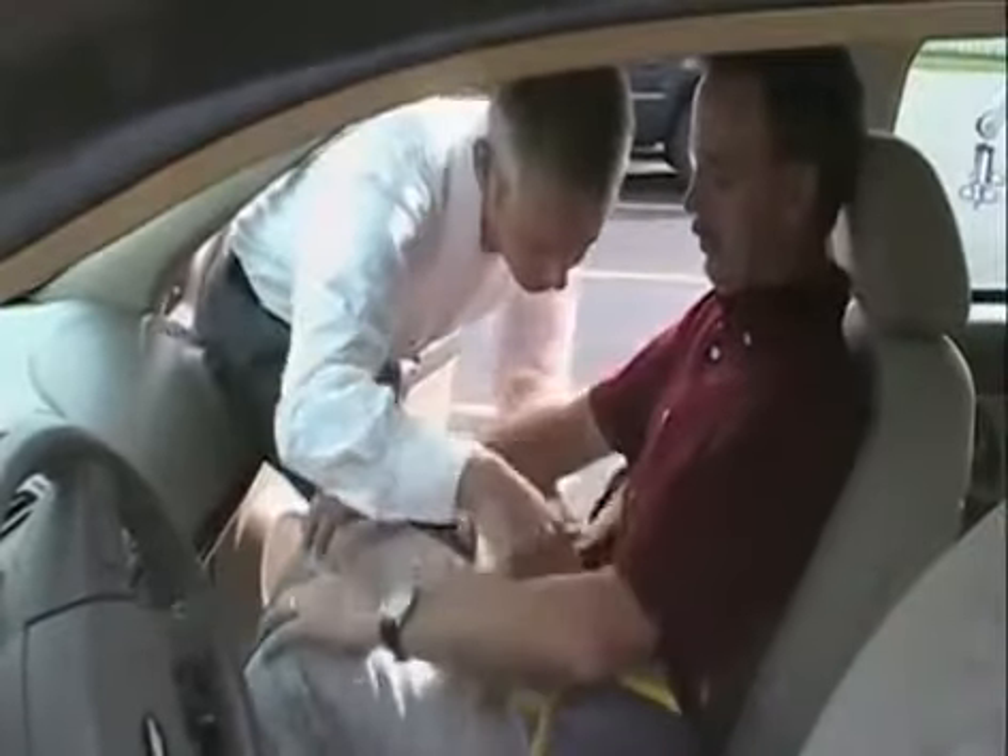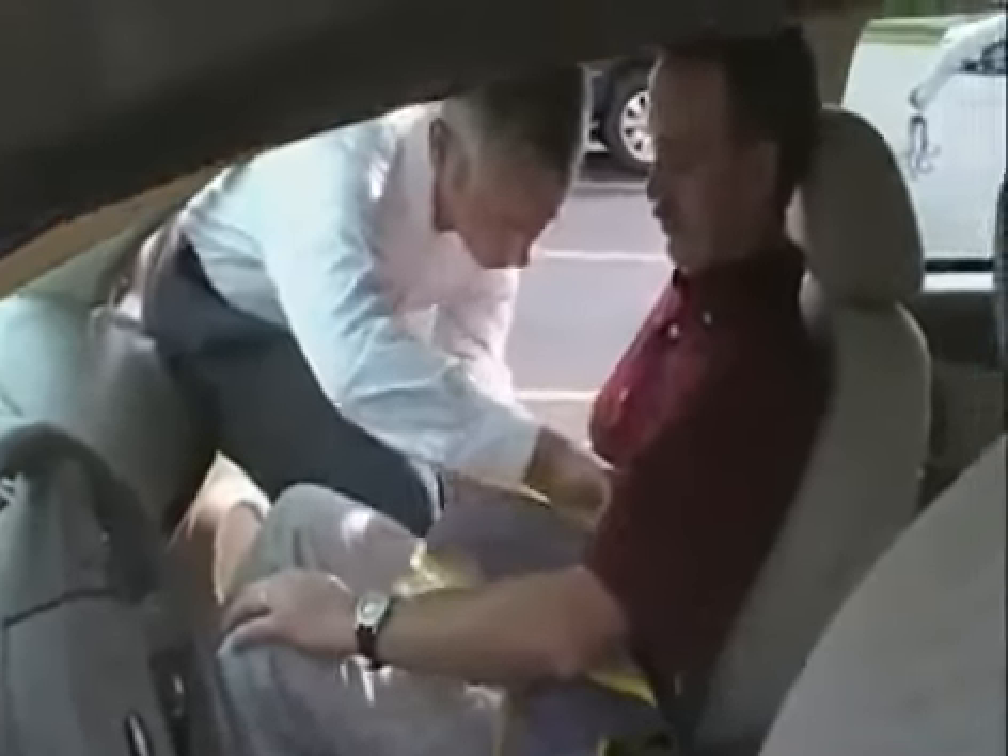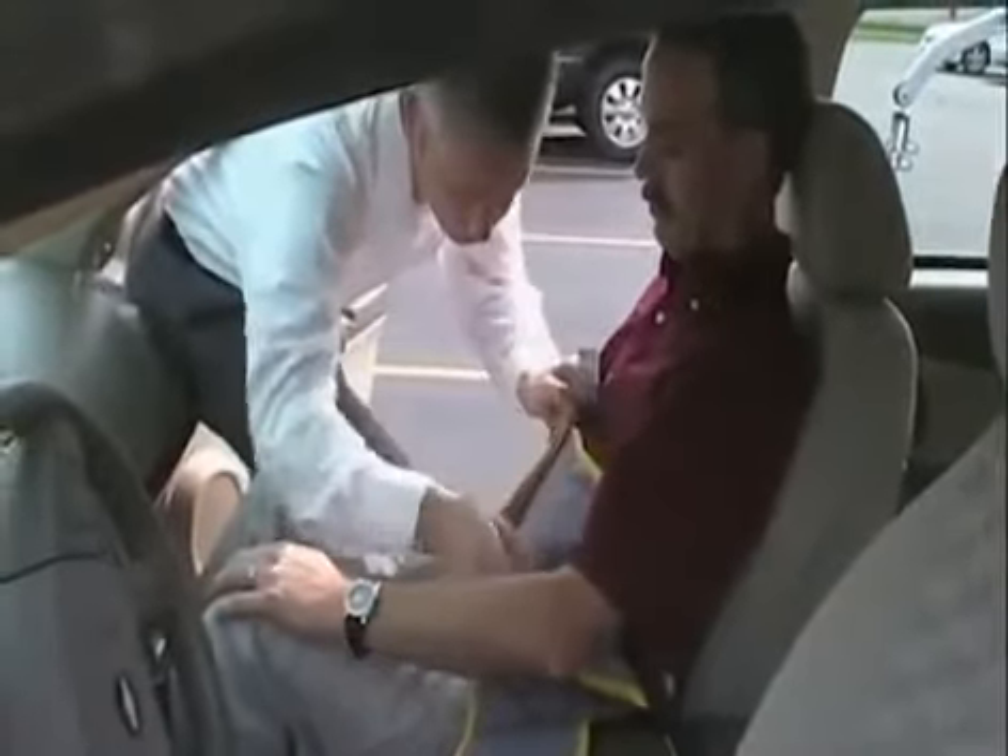If you can lift up your arms for me, that would be great. I'm going to draw these two straps across. There's actually Velcro on them, so I'm going to wrap that in place, and that will help to keep it comfortable and help to lift you.